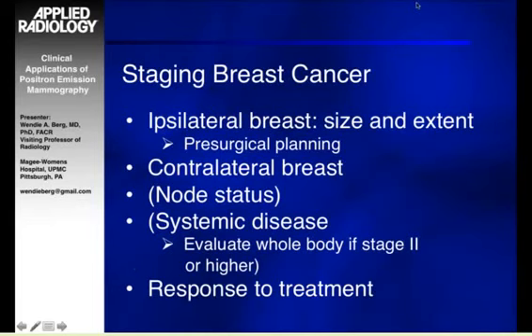And then finally, I think a very exciting area for PEM especially is to look at response to neoadjuvant chemotherapy. So these would be patients where they would be imaged prior to treatment as well as after, for example, one cycle of treatment to determine whether or not their tumor is in fact responding, and if not, to consider a change in the chemotherapy regimen, and then finally to look at the disease extent again prior to surgery. And certainly there is a need for better options in this regard, although MRI again is being used for this, and certainly we need more studies in this area.